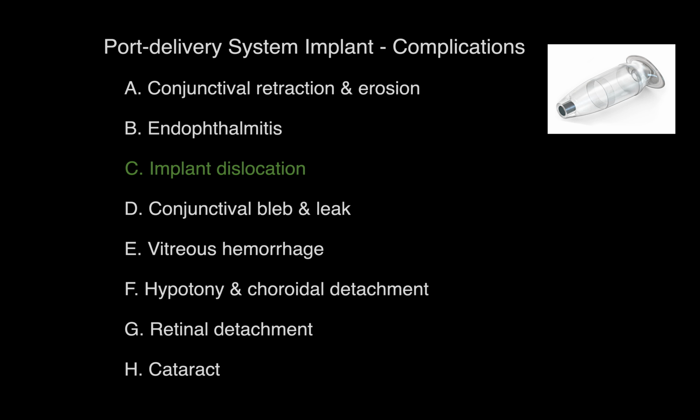Recommended management for implant dislocation: for dislocation outside the vitreous cavity, prompt surgical intervention is recommended. For dislocation into the vitreous cavity, surgery is advised most of the time, although timing will depend on associated factors and depth.